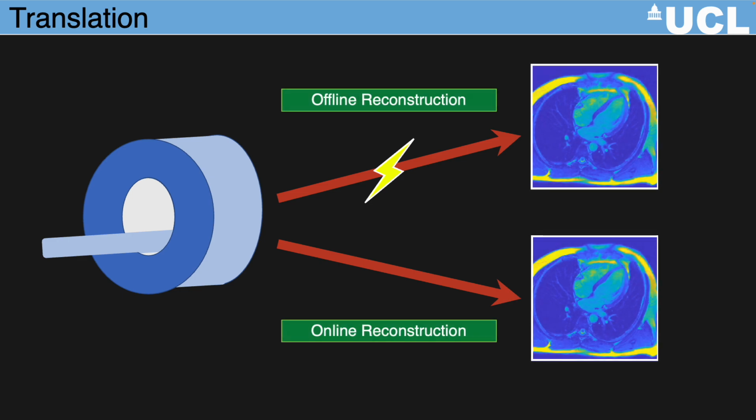These implementations have different advantages and disadvantages, and the pathway chosen may be dependent on the complexity of the reconstruction, the number of subjects it's to be used on, whether the images need to be viewed while the patient is on the table, and ultimately the skill set of the researchers involved. The chosen pathway will have an impact on the software languages, accessibility of other languages, and the hardware available.